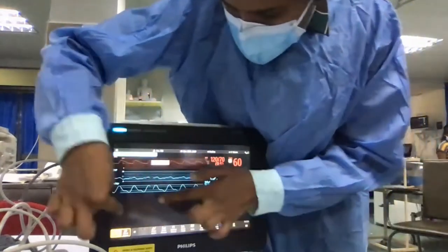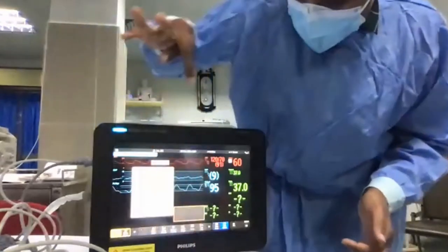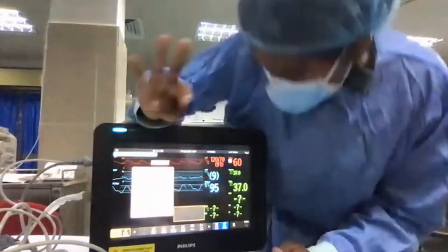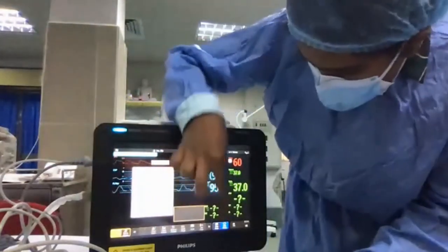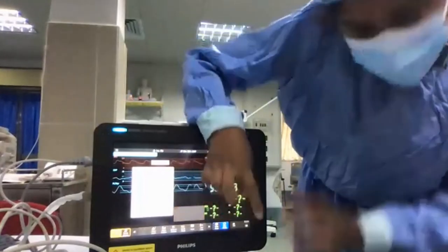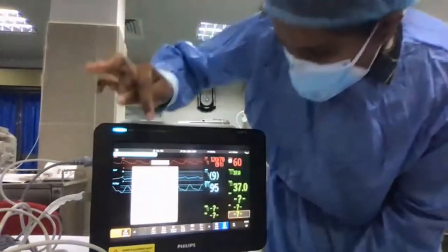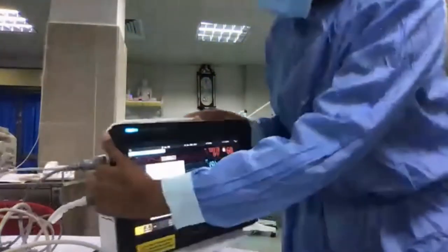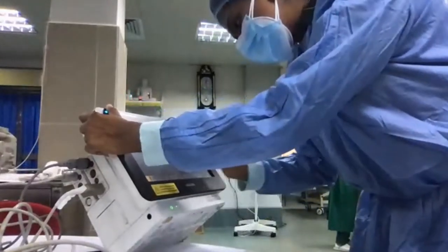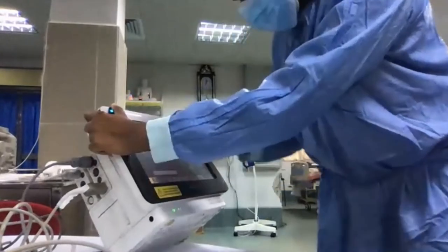there are blank spaces over here. Can you see? These are blank spaces. So just click on one blank space, not over here because it's already assigned for NIBP, so I can't use that. Let's say here, for example, SI. Just imagine this is a blank space. Click on it and then, hold on. Because it's already assigned, I can't change that. All these are assigned for something. Ah, yeah, I can change. Okay, so there's one space there.